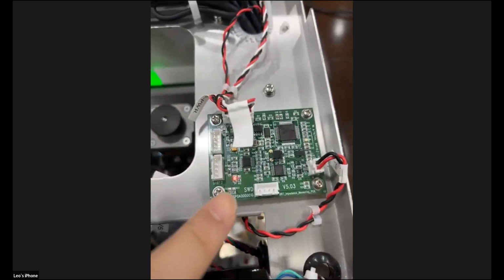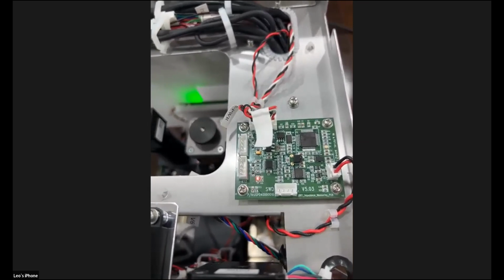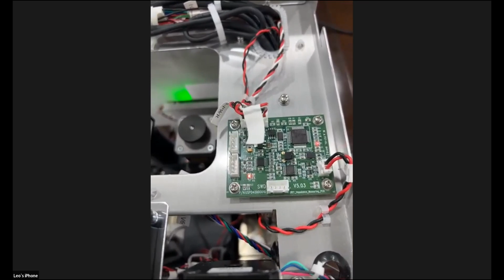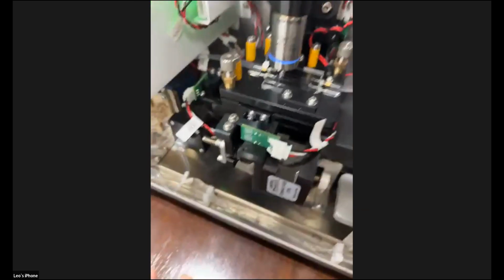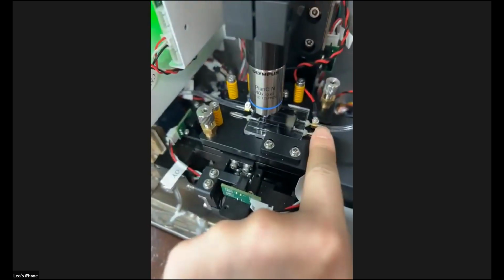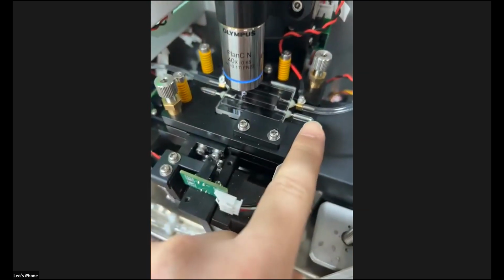And here is the impedance board, which, like Mr. Chang introduced, tests the conductivity and osmotic pressure of the samples. We can see that here is the microscope platform, and there are two tubes connected to the flow chamber, two parts, from the bottom and the top.